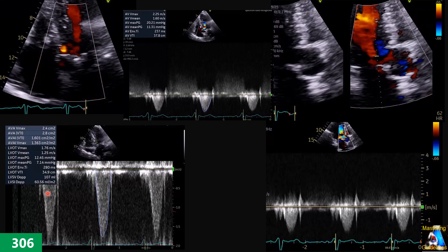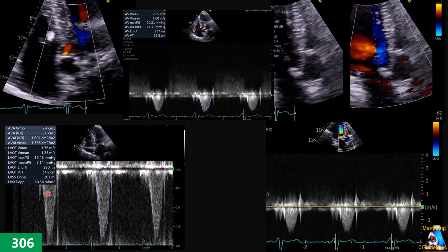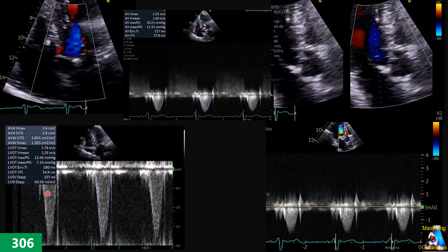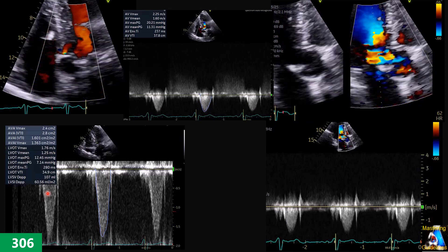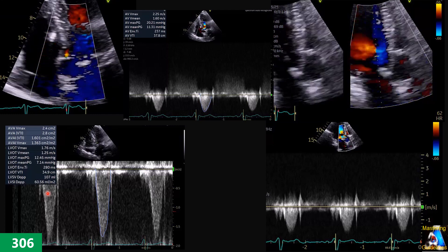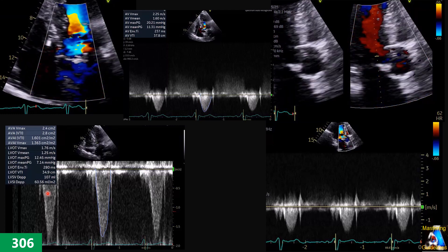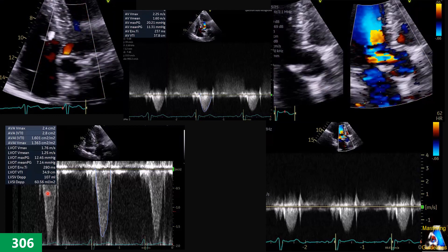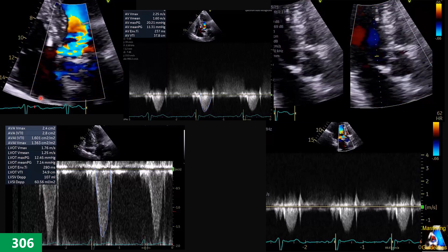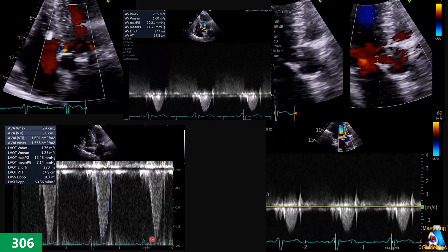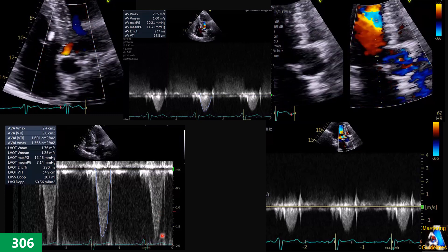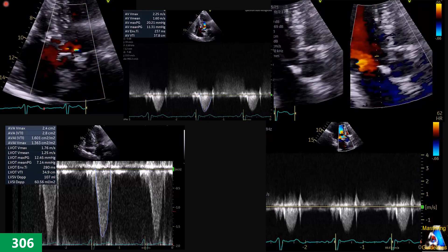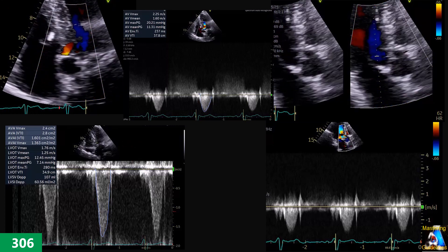If the patient has symptoms, again, we have to perform Valsalva. Besides the other studies like speckle strain that I explained in other lectures — in this case, we can see there is no significant obstruction at rest, but there is a slightly increased velocity at the LVOT, almost close to 2 meters per second with the sample volume at this level. So in this case, we have to do Valsalva maneuver. Now let's see how we perform it.